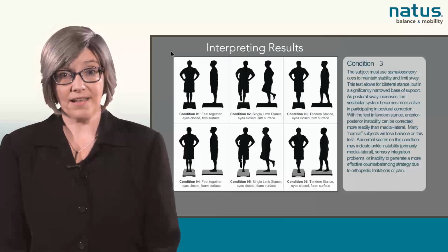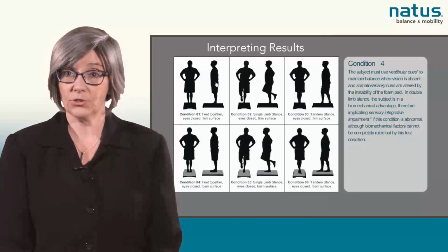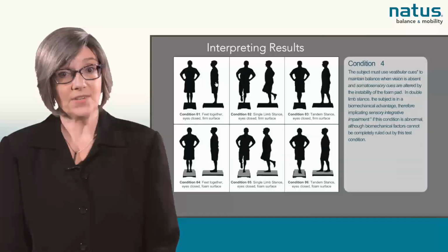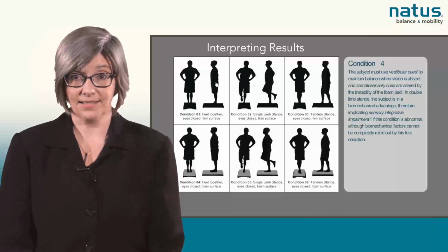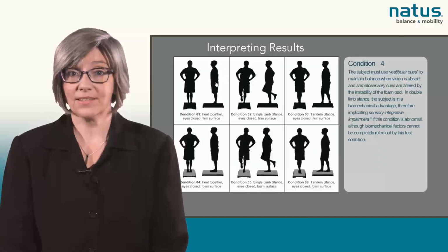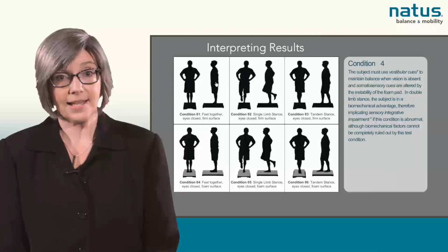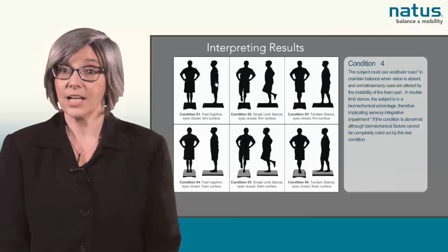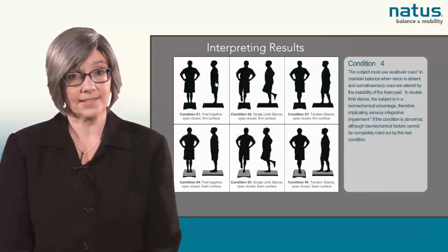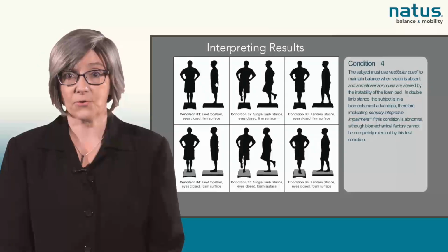Conditions 4, 5, and 6 on the SET protocol are the same as conditions 1, 2, and 3. First, feet together, then single leg stance, and then tandem stance, all with hands on the hips and the eyes closed. But in conditions 4, 5, and 6, the patient is now standing on an unstable surface. Conditions 4, 5, and 6 on the SET protocol utilize the Airex foam pad on top of the force plate.